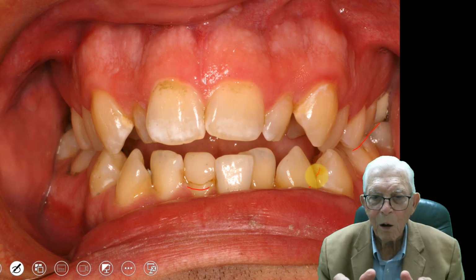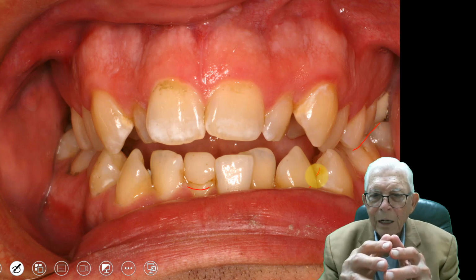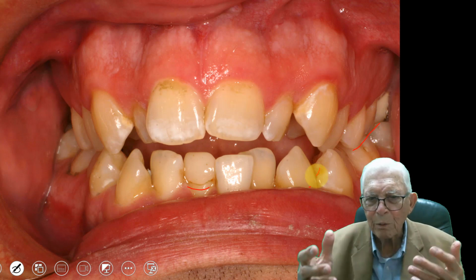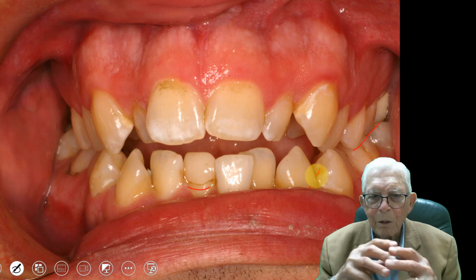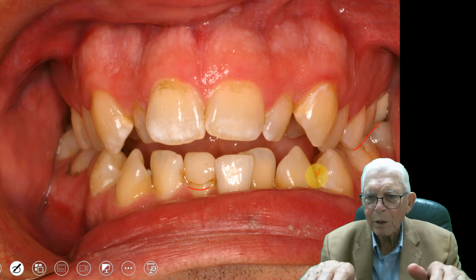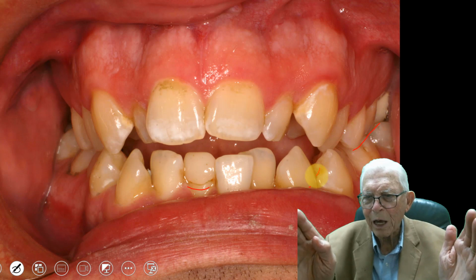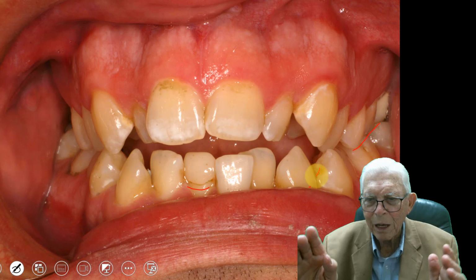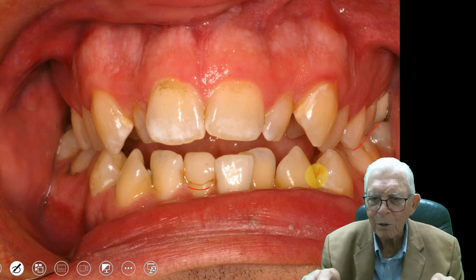All right, you get older people that have this breathing problem and go in and widen their maxilla up here. Well, a lot of these people, you say, well, I can't separate you with a palatal separator, but you can. Now we use these big arch wires on the outside, and we put torque in the upper teeth to keep the roots from going out to the buccal when you bring the crown out like that. And we'll try to go over that in another day, how we do that.